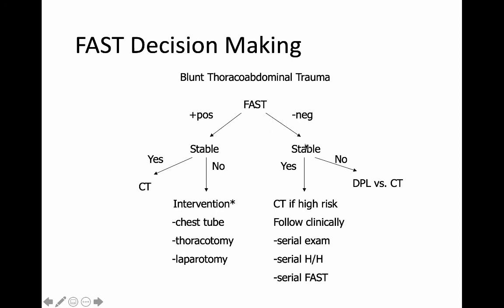Well, if it's negative and they're unstable, then resuscitate, think about other sources, and then repeat it in 10 or 15 minutes after resuscitation, because maybe more blood has accumulated in the abdomen, or other injuries have accumulated that will be more visible in the next 10 or 15 minutes during your resuscitation.